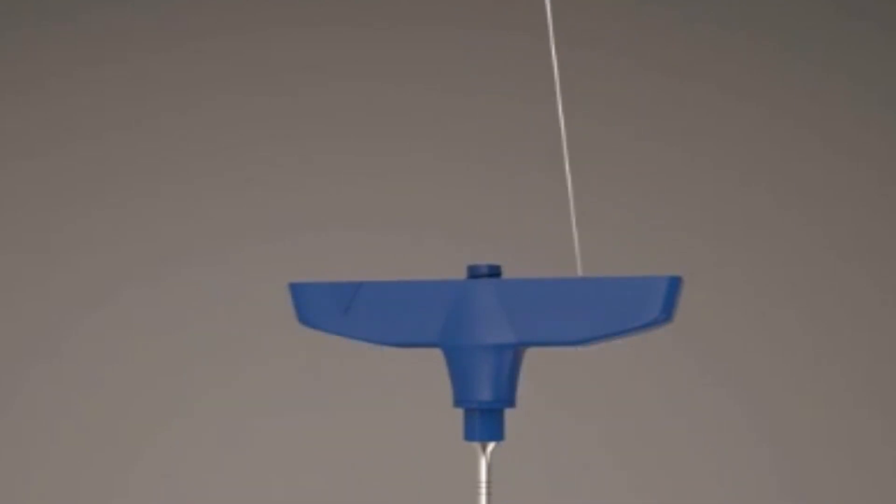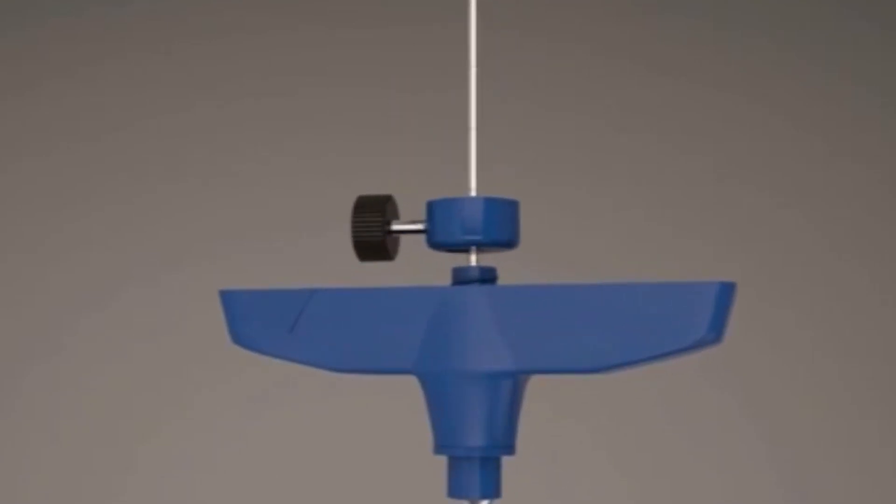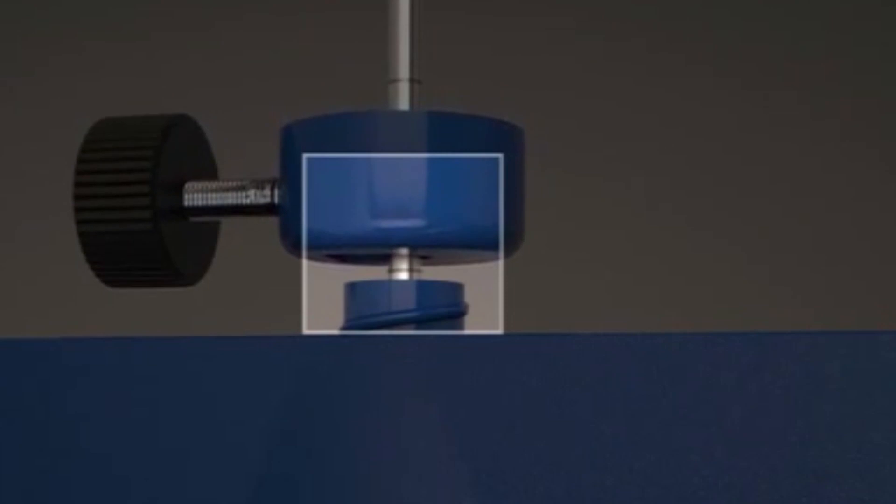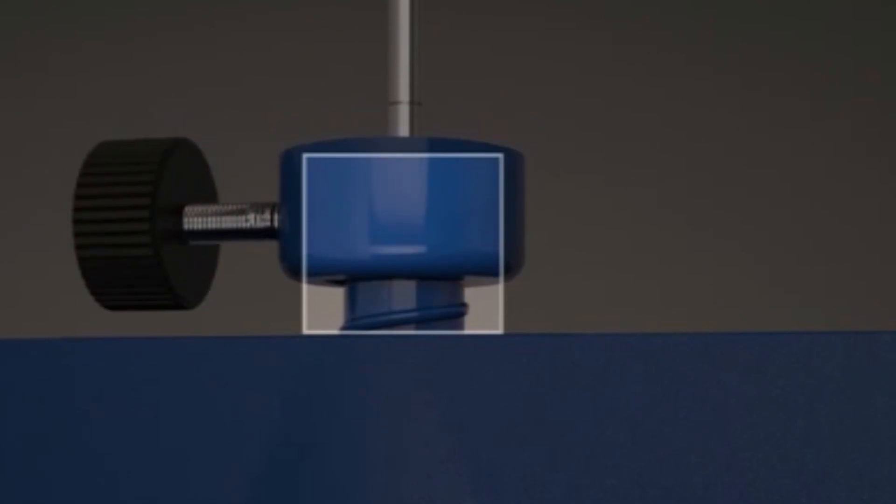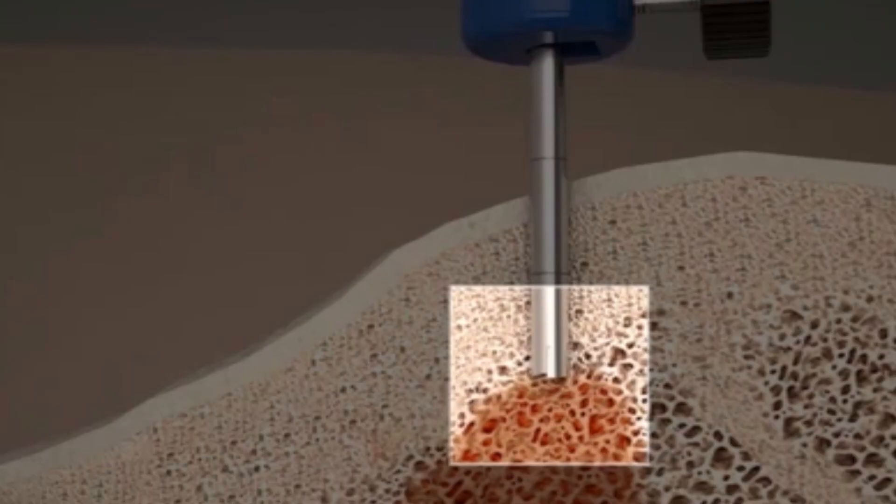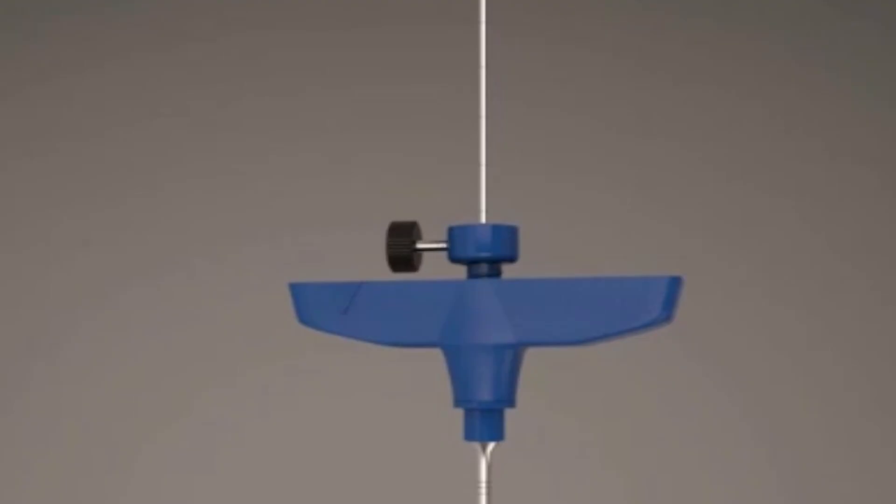Now, you may begin your biopsy. Placed in the cannula, the double mark on the biopsy needle indicates zero protrusion past the tip of the cannula. The adjustable stopper is set to the desired depth.